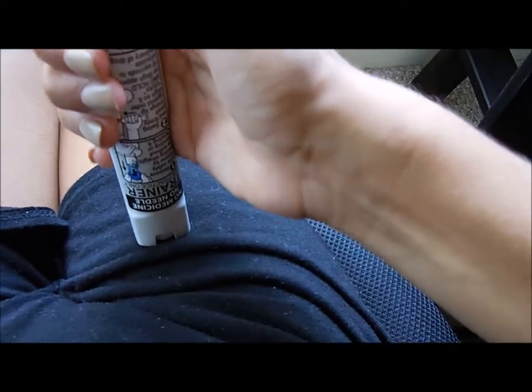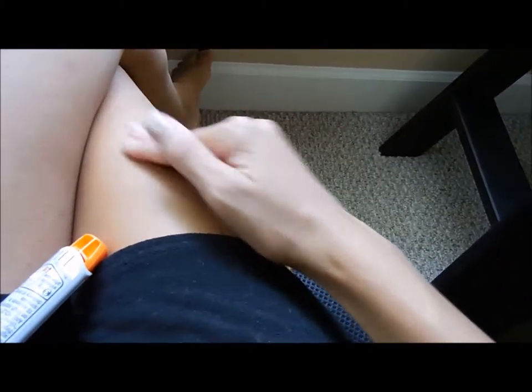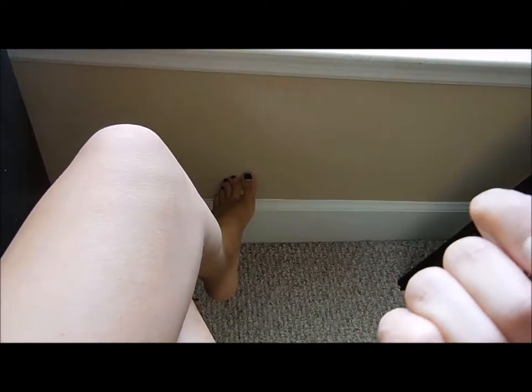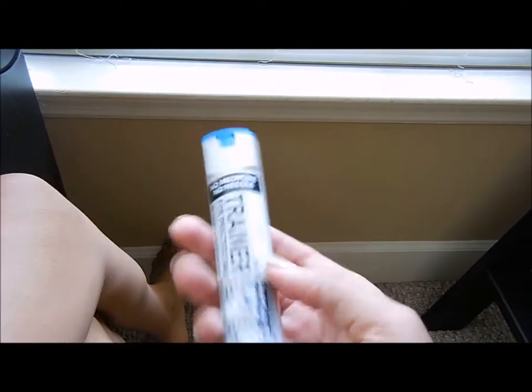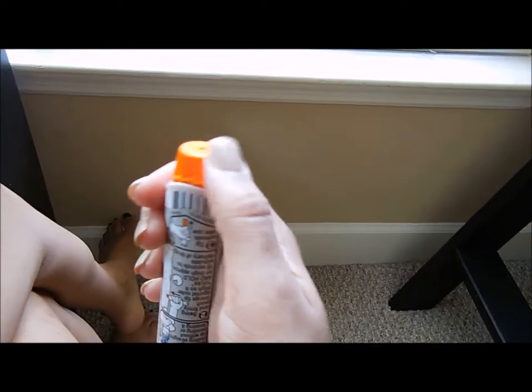After that, you're going to properly dispose of it by putting it back in the case. But before you do that, make sure you rub that area for about 10 seconds, and make sure you don't touch the needle part. Then either call 9-1-1 — because the medicine is going to wear off soon and your symptoms could come back — or call a friend to take you to the hospital.